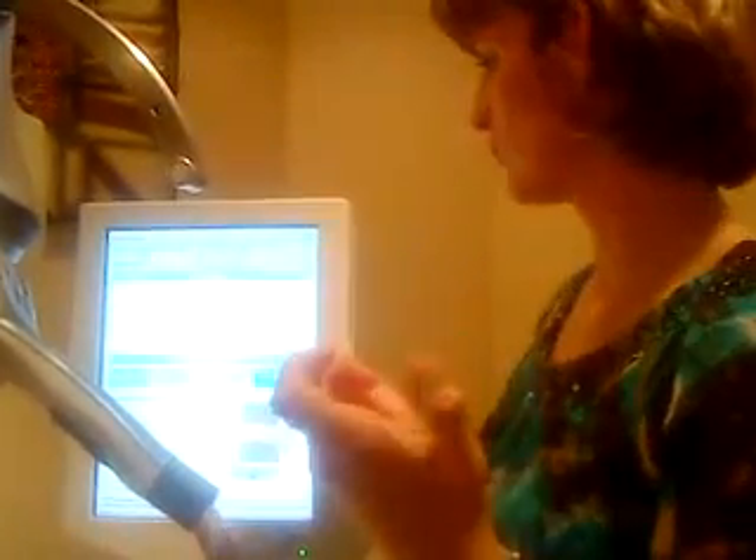So I put all the coordinates in and move five centimeters forward. Once you find the motor threshold, you go through some different tests because it gives you an average of intensity — you go to low intensity, high intensity, to help figure out the average of what you want for regular intensity. Then we go forward.